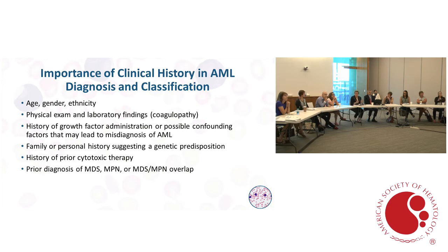If we see the same set of abnormalities or a particular structural or numerical gain, that's considered a clone, and if we see it in 2 cells, it's considered a clone. If we see the loss of a chromosome, and that's the only abnormality we see, you have to see it in 3 or more cells. But that can also be FISH confirmed as well, so we can fine-tune that. Did you have a question?